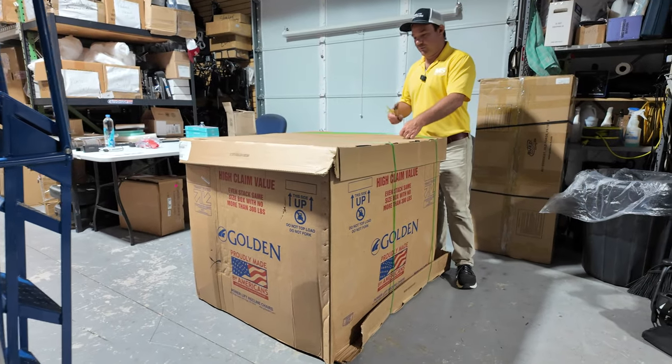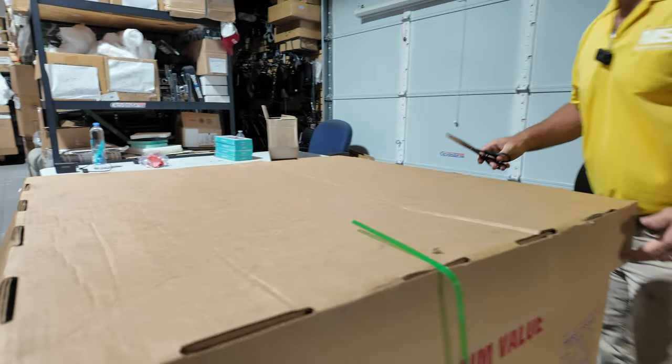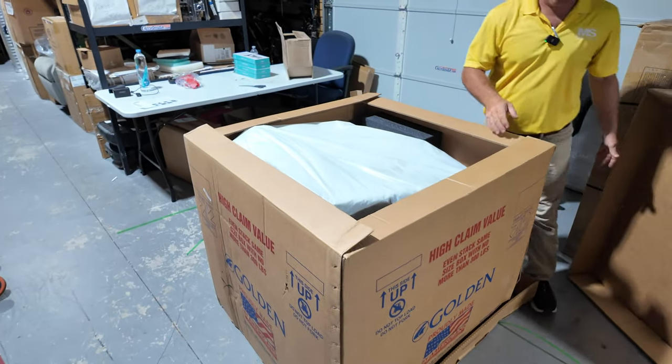If you do choose the curbside service, the box is going to come in like this. You're just going to cut those straps and remove the top. This is our first time unboxing this chair — we just got it in.